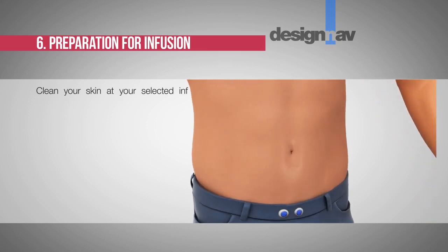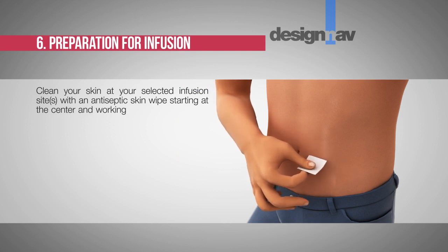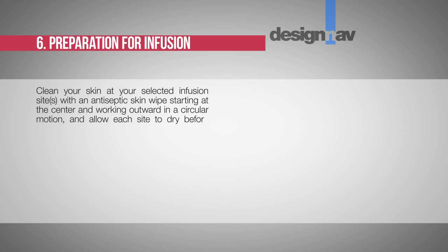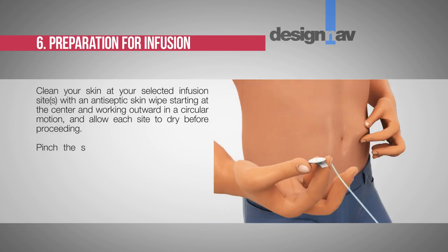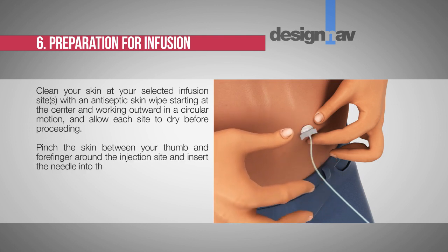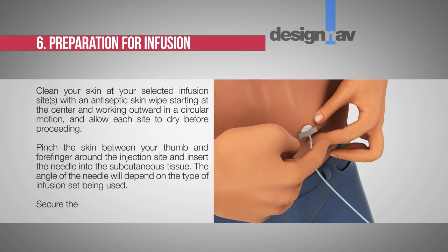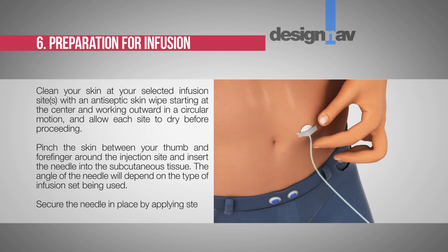Step 6: Preparation for infusion. Clean your skin at the selected infusion site with an antiseptic skin wipe, starting at the center and working outward in a circular motion. Allow each site to dry before proceeding. Pinch the skin between your thumb and forefinger around the injection site and insert the needle into the subcutaneous tissue. The angle of the needle will depend on the type of infusion set being used. Secure the needle in place by applying sterile gauze and tape or a transparent dressing.